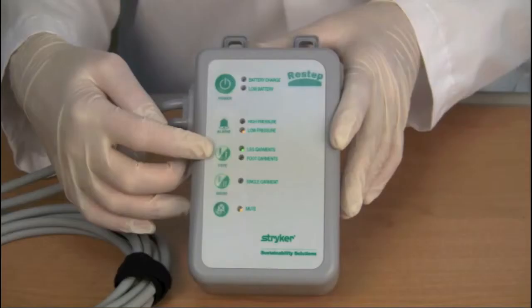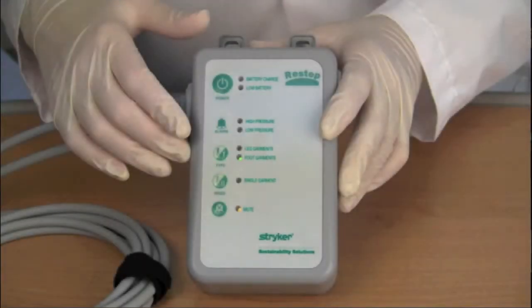The garment type button is used to choose garment setting. The default setting is leg garments, which is the setting used for calf, bariatric, and thigh garments and gives a pressure of 40 millimeters of mercury. Press the garment type button to choose foot garments. This gives a pressure of 80 millimeters of mercury.